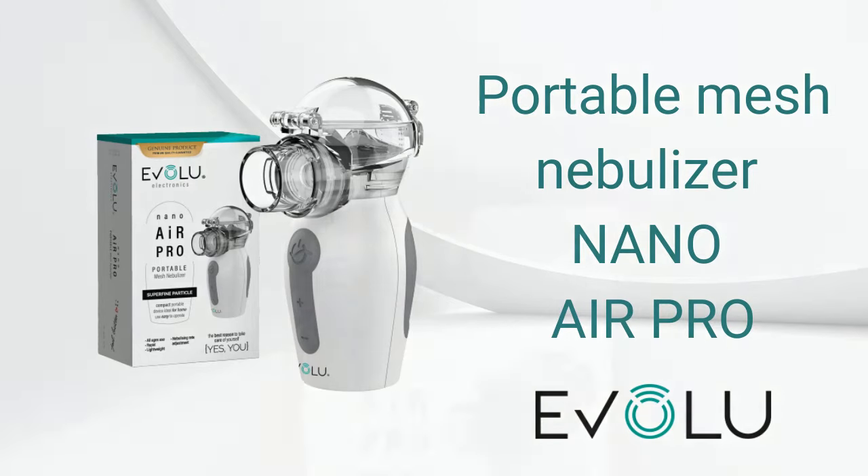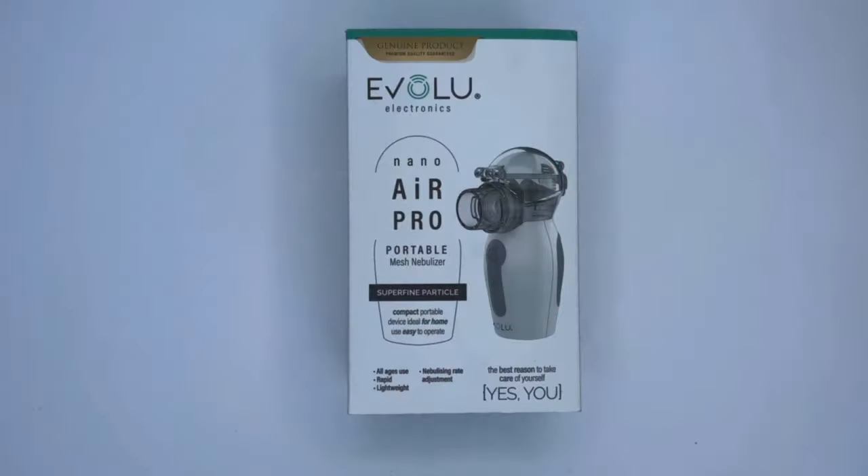Evolu Inhalers Nano Air Pro. Like other Evolu inhalers, the Nano Air Pro can be used by adults and children. Please note, when performing inhalation for children and people with disabilities, adult supervision is required.